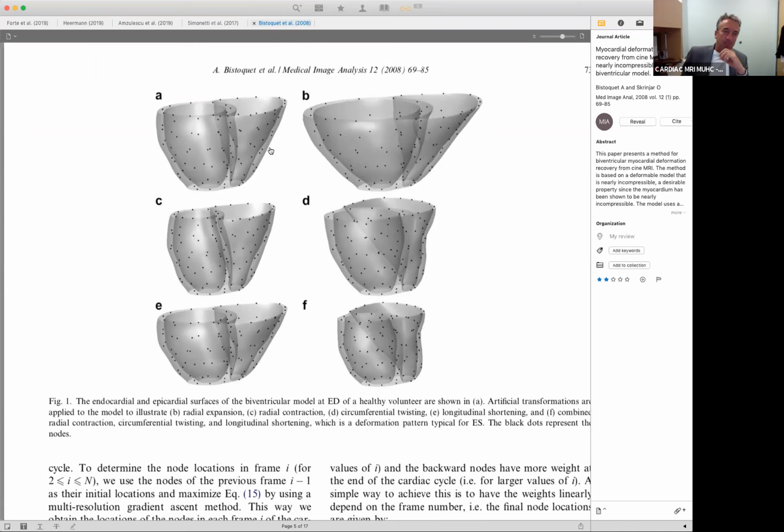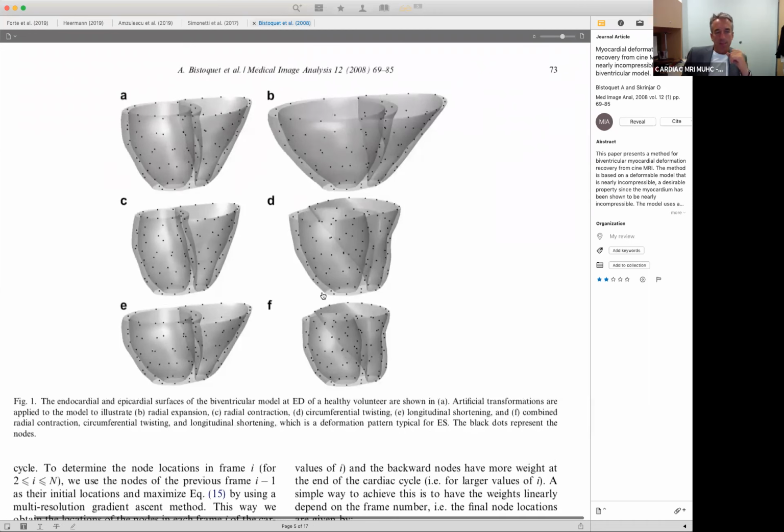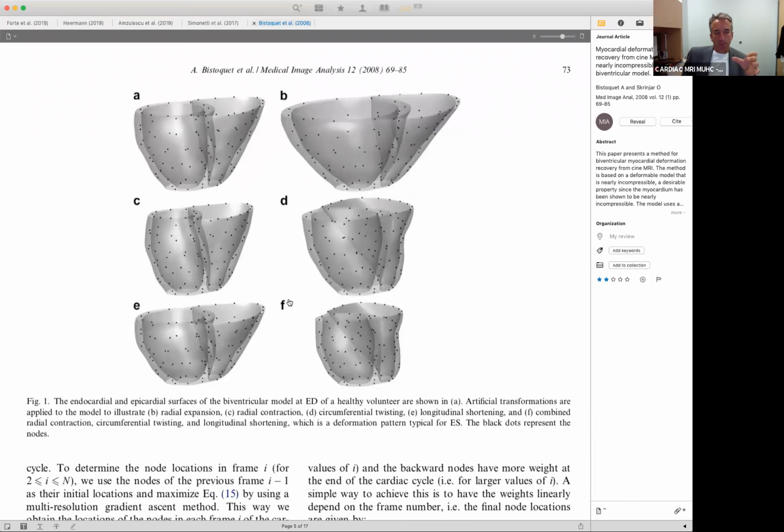Thank you. So in systole and diastole, anatomical landmarks are used based on the contours, and then using the assumption that the heart itself, the myocardium, cannot be compressed significantly, the shape has to go from this to this. And so these are the three different examples on how you can assess that.